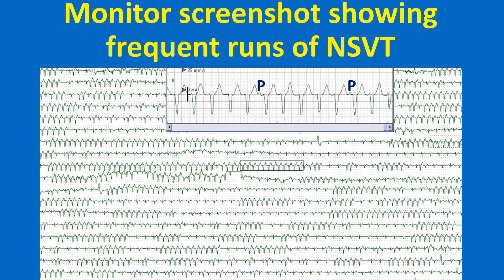This monitor screenshot shows frequent runs of non-sustained VT. Dissociated P waves are seen very well, indicating the ventricular origin of the tachycardia. P waves are seen before the 6th and 11th QRS complexes with different PR intervals, indicating that they are dissociated P waves. The P waves are of sinus origin and do not get conducted to the ventricles because the ventricle is already activated by a faster ventricular rhythm. Retrograde conduction from the ventricle into the AV junction and anterograde conduction from the sinus node cancel off — this is a form of interference AV dissociation.